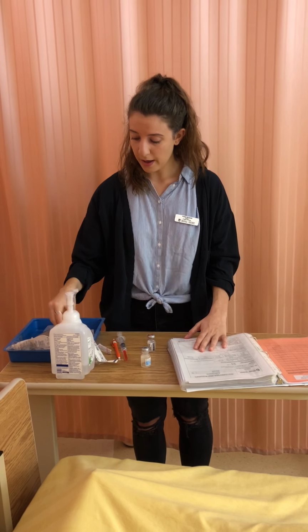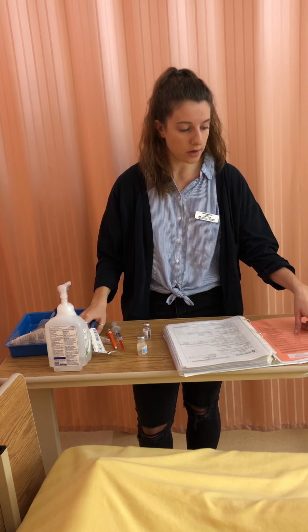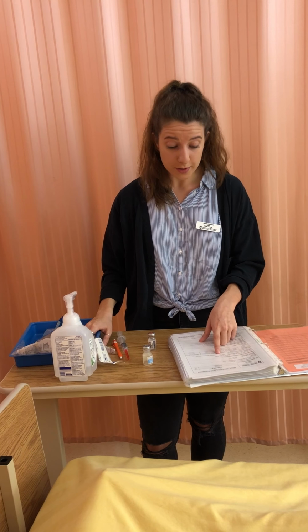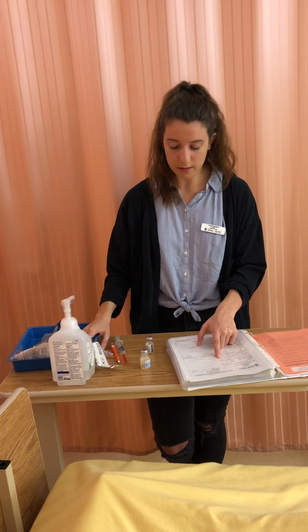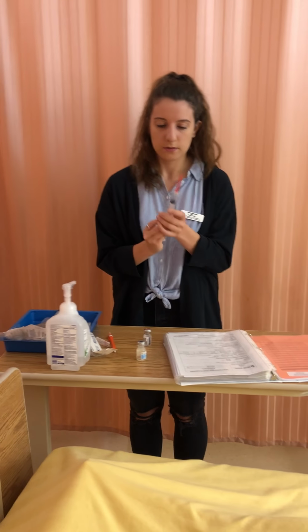I've done the math already for it. So I've done dose desired over dose on hand. My dose desired is 400 milligrams over my dose on hand, which is 100 milligrams per mL. So I will be drawing up a total of 4 mLs. So I'm going to get 4 mLs of air into my syringe.